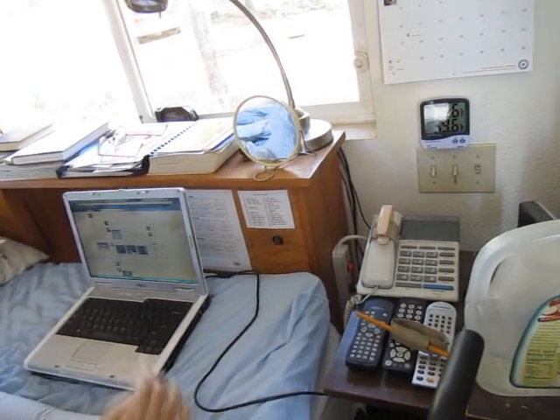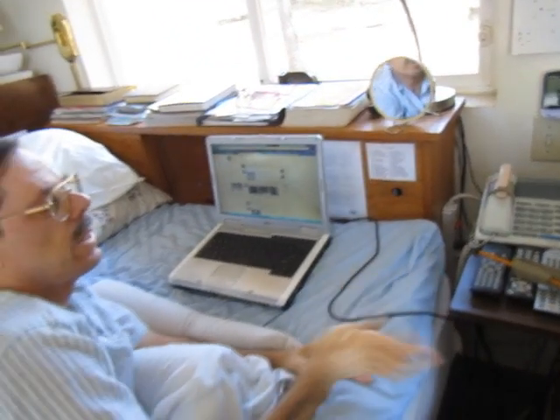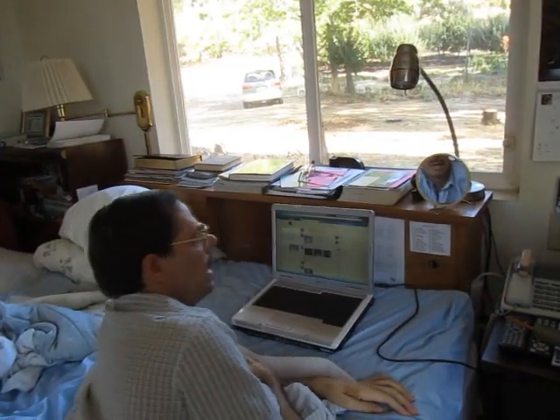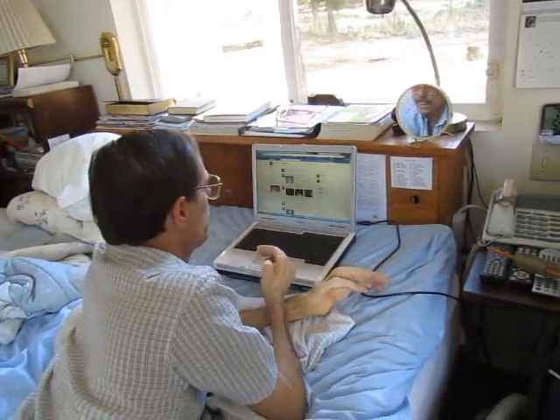And that will turn on the power to my computer, to the webcam, to the speakers, to anything else — including my light, which is a touch light, which is really nice to have. And I'm ready to use the computer.